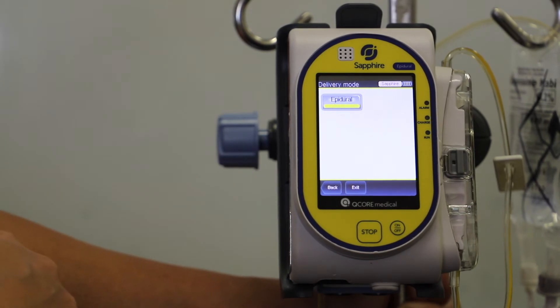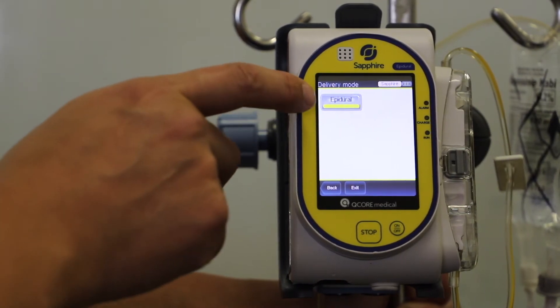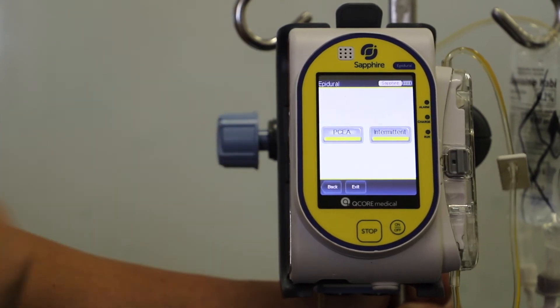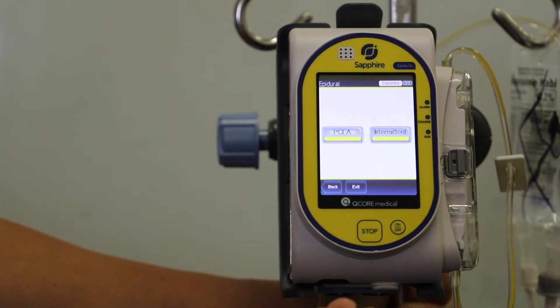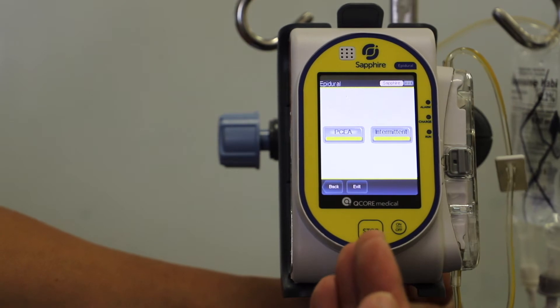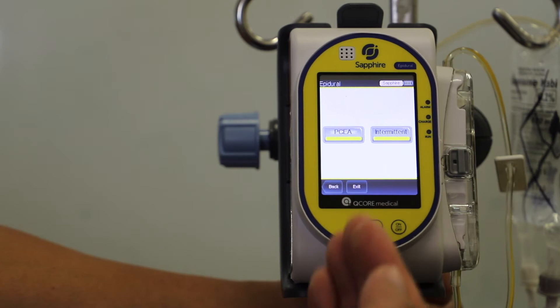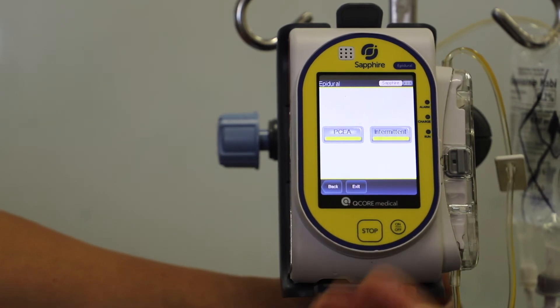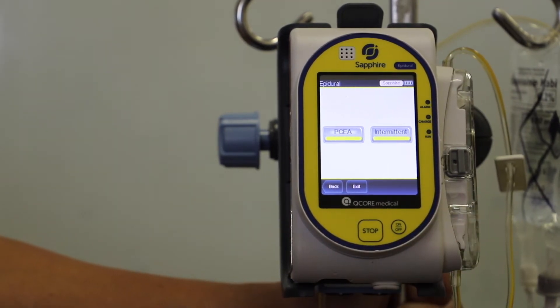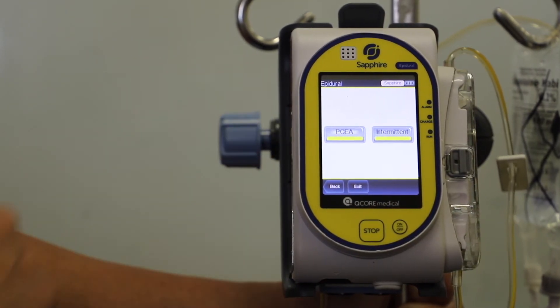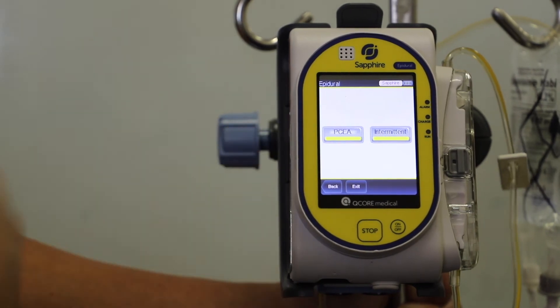You'll be prompted by a selection where it says epidural. Click on that, it will give you two options. The two options will say PCEA, and this is what we would select for a continuous infusion, as opposed to an intermittent, which is for program intermittent boluses. So we select PCEA for continuous.